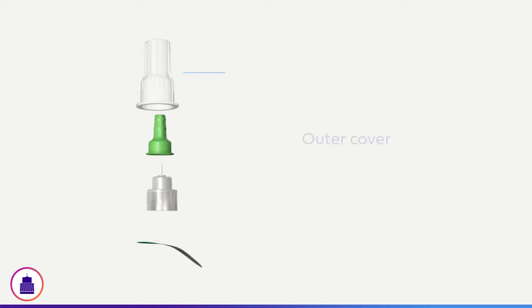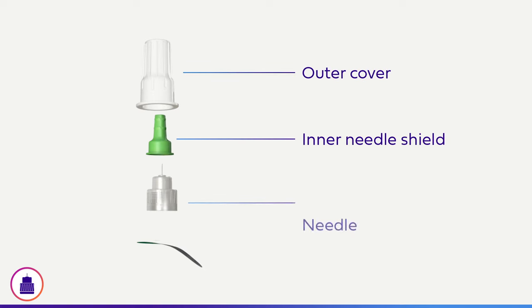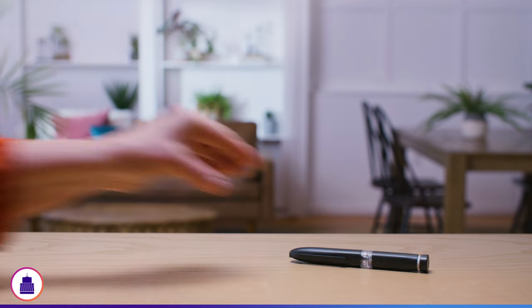The pen needle consists of an outer cover, an inner needle shield, a needle, and a peel tab that provides a sterility seal. First, gather all your supplies on a flat surface. You will need your insulin pen, pen needle, alcohol swabs, and a sharps container.